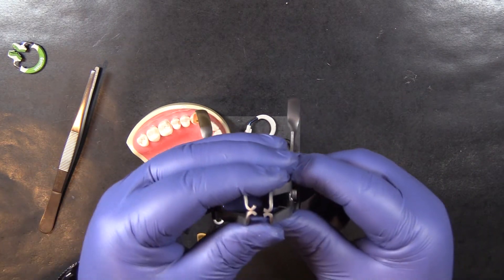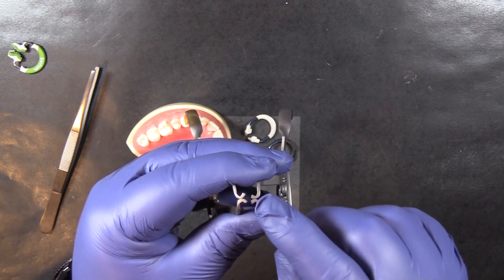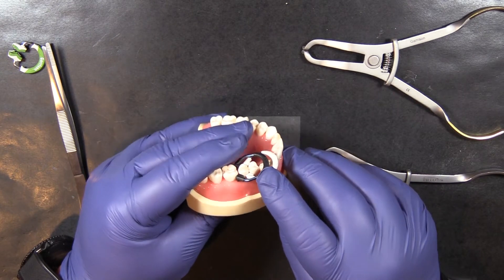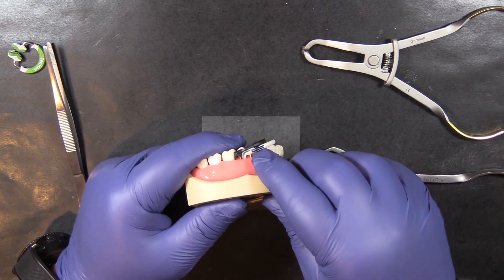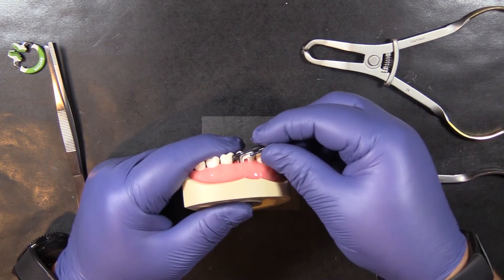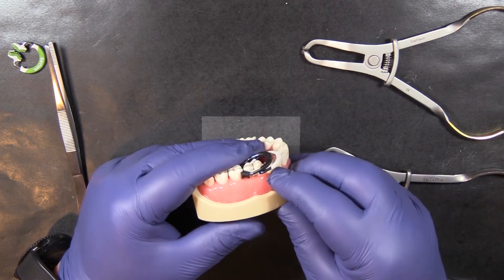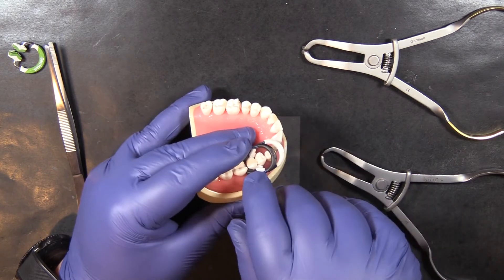I'm going to show you here why it matters. The Nitin tips are just a little bit shorter. Nitin sectional matrix rings are thinner than Garrison Composite rings and they sit very closely together when you stack them on a premolar.